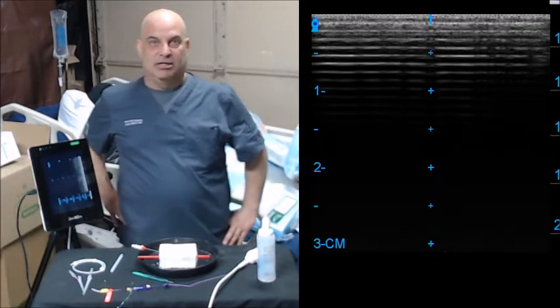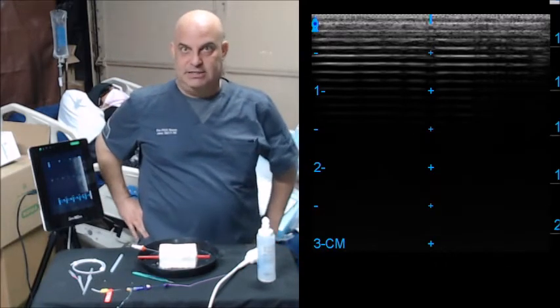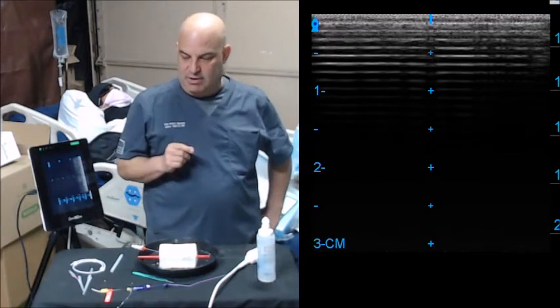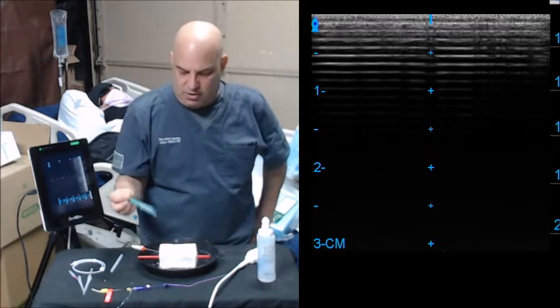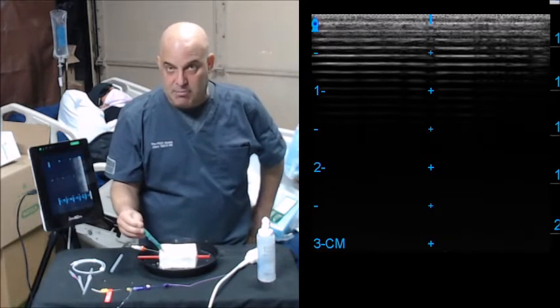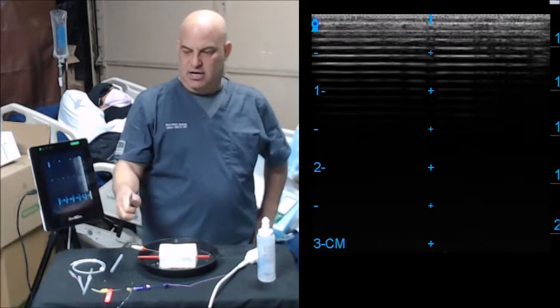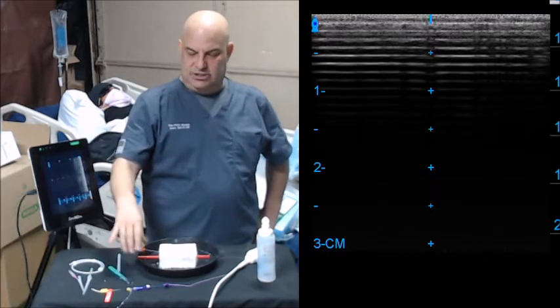Sure, I mean a little bit of drive time and a little bit of paperwork, but PICC nurse has the easiest paperwork ever. And that's all you have to be able to do is get that introducer into the vein. Take your scalpel and make a little slice in the skin, a sixteenth of an inch, get the introducer into the vein.